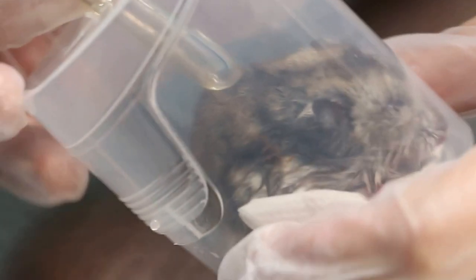One has to be very careful, yeah. Okay, the little video on your side, but normally what I do is just so there'll be a bit more gas again. And one has to be patient, patient. Anesthesia. Okay, not too much and not too long.